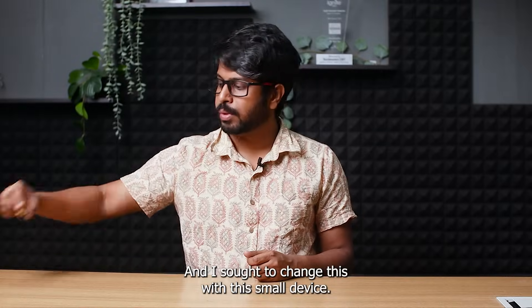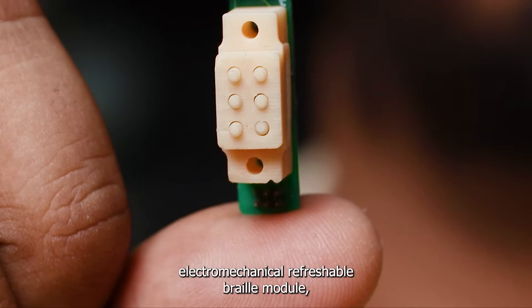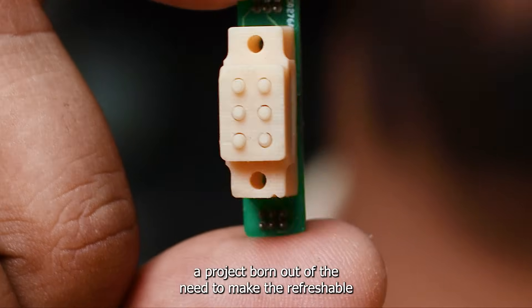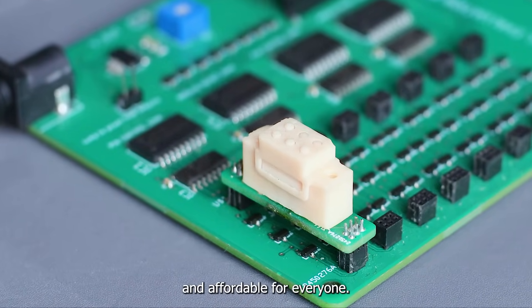And I sort of changed this with this small device — introducing the electromechanical refreshable braille module, a project born out of the need to make refreshable braille devices more accessible and affordable for everyone.